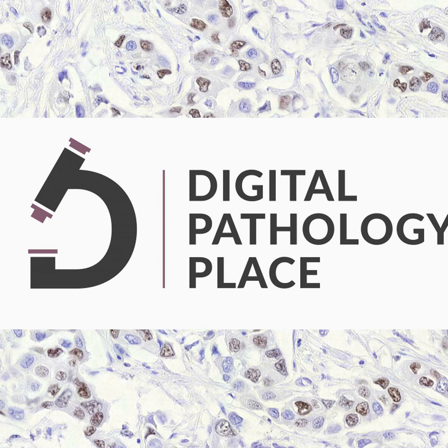So, you can have a scanned image of a slide, and you can say that this individual pixel is a part of the nucleus as opposed to part of the cytoplasm, or this is part of a mitotic figure or whatever. Or it's part of an area that has tumor in it, or that has a particular kind of adenocarcinoma of a particular tissue, or it could be an anatomical classification. This is part of a lymph node. And so the annotation spans the entire spectrum. So one needs to be capable of representing annotations at all levels, whether they be categorical or quantitative.